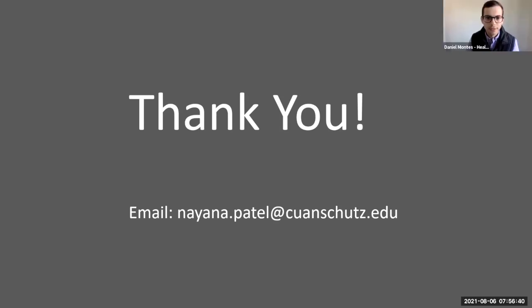Thank you. The next two questions have to do with the post-biopsy scenario. The first one is, I wonder if post-transrectal ultrasound biopsy changes may confuse diagnosis of prostate cancer. Yeah, the hemorrhage within the prostate after biopsy can stay there for a long time. It can hinder the evaluation for prostate cancer.